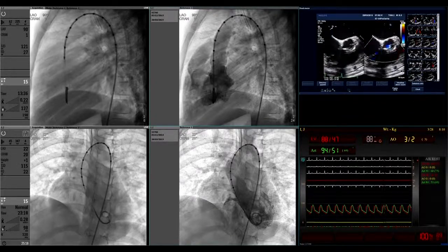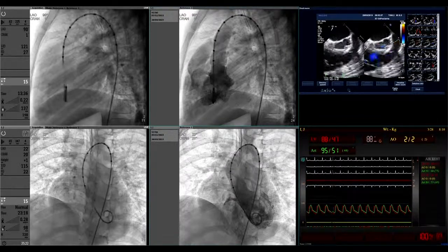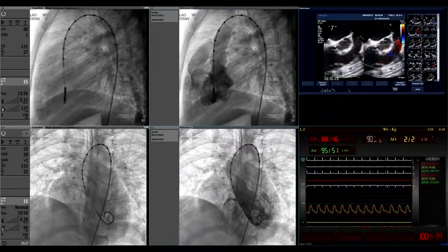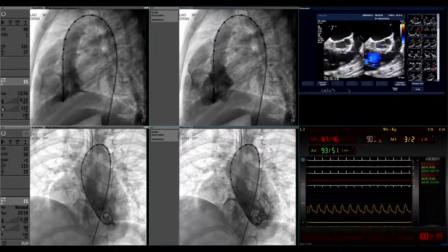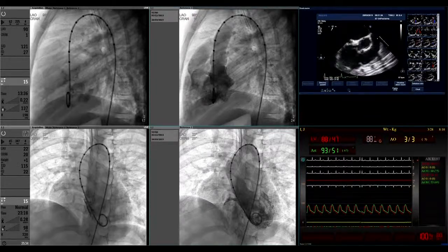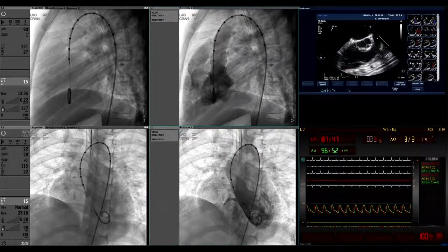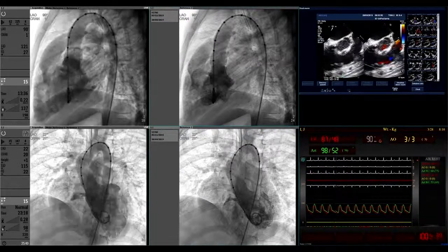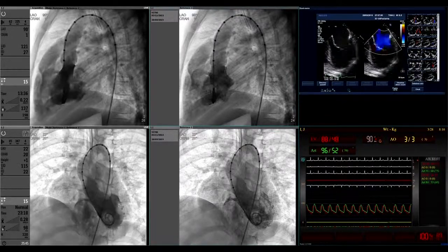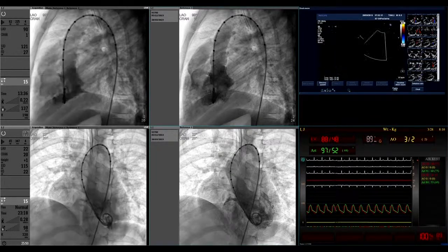You guys in India have a huge experience going retrograde. I think you could tackle this case in this manner as well, maybe with the ADO2, 6 millimeters. I don't know. What about you, Raul? Well, if you look at the color Doppler, you can see that the main jet goes downwards to the apex of the right ventricle. And I think that's a fine case to go through the aorta, go directly to the VSD and close it without an AV loop.